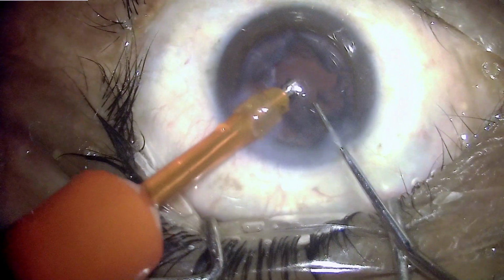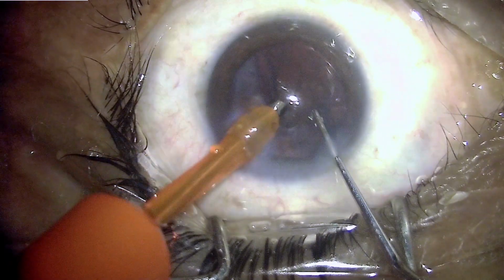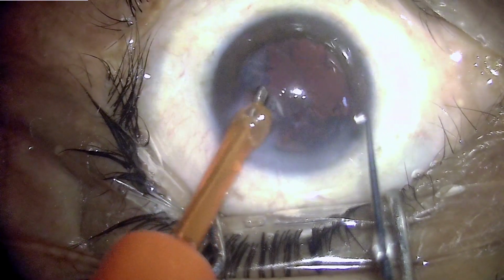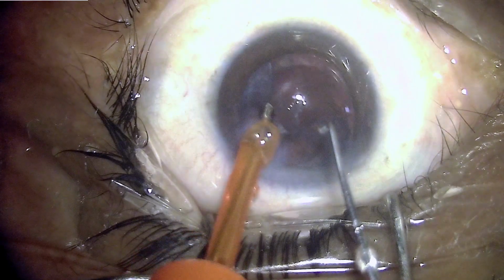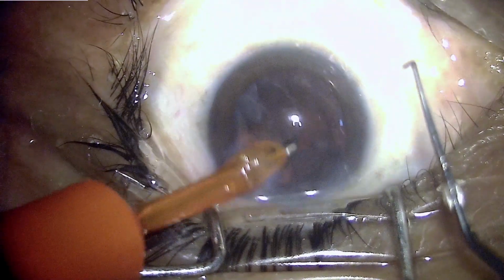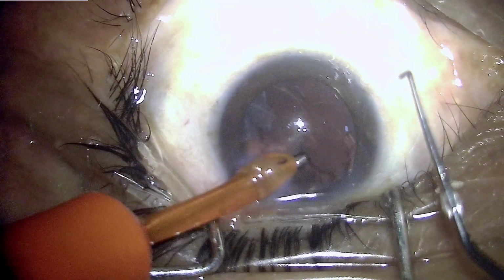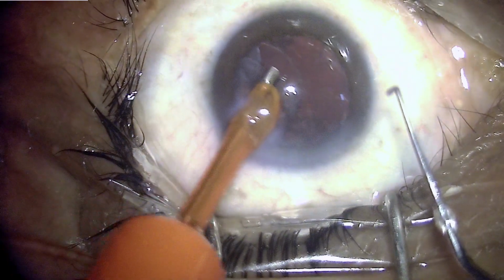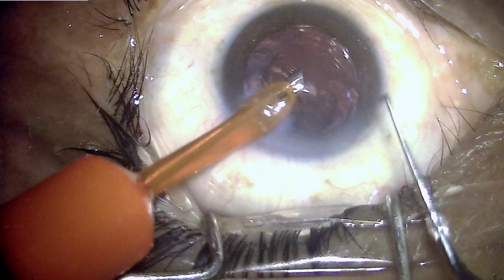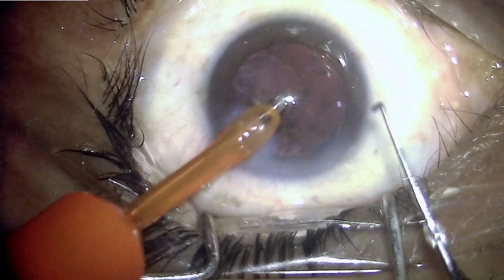The nucleus has been removed, and it is now the turn of the epinucleus to be removed, and as we can see, the subincisional portion of the epinucleus is still retained, and I am adamant to remove this using my phaco handpiece and the tip. So I am manipulating the handpiece such that it can reach up to the epinucleus, which is nearly in the subincisional area now. This was a little extra effort on my part, but I could see that I have been able to remove this epinucleus with some success.